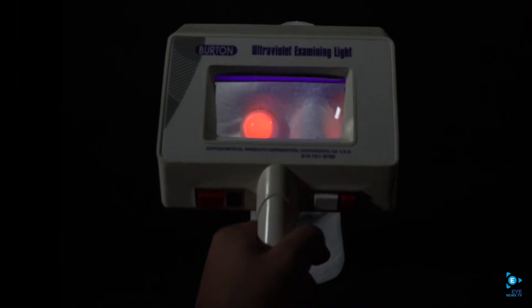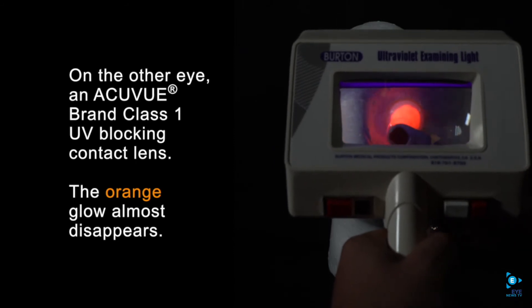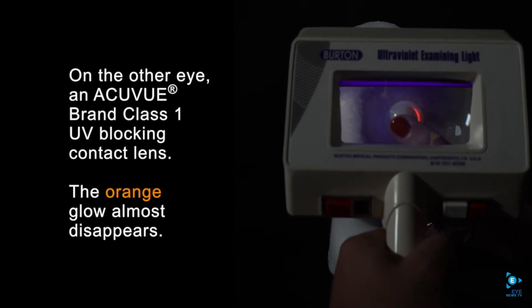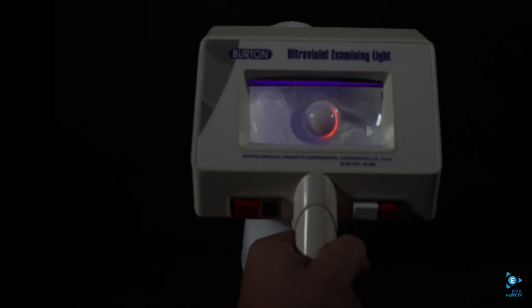Now I'm going to place an AccuView brand Class 1 UV blocking contact lens on his left eye. And you'll be able to see that the UV, the bright orange glow, disappears almost completely.